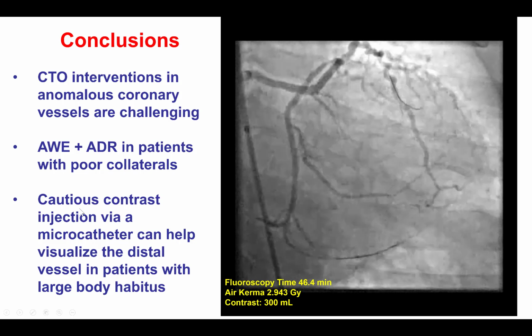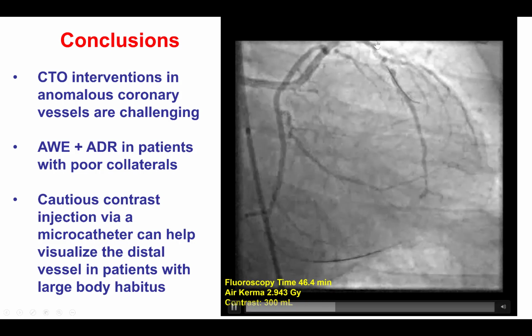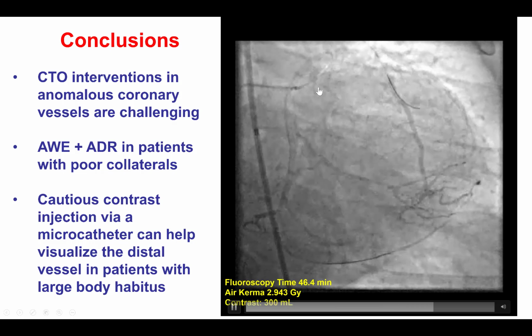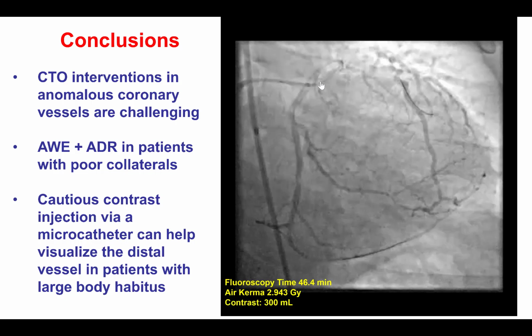And also we had to use injections through a microcatheter and also through a deeply intubated guide extension to be able to visualize the vessel and confirm that a nice result was achieved, together with performing intravascular imaging with IVUS.